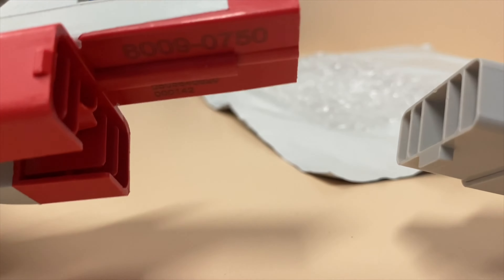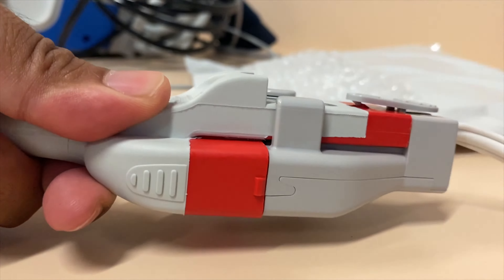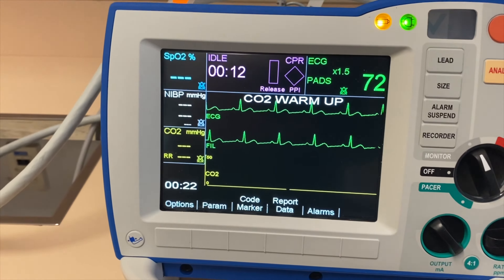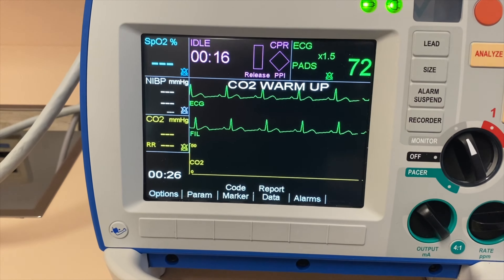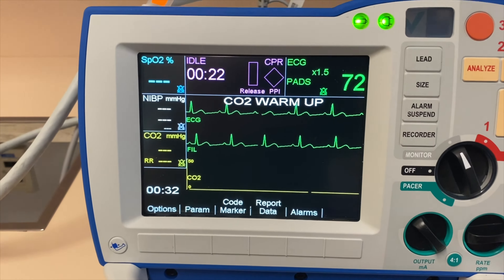To put it back, or if you're putting a new pad on it, you just want to make sure that you put the pieces together and slide it in. When you turn on this Zoll defibrillator to monitor mode, this is how it's going to look. So you have your SpO2, NiBP, CO2, and on the top you will have your CPR feedback area. You have your ECG and pads.